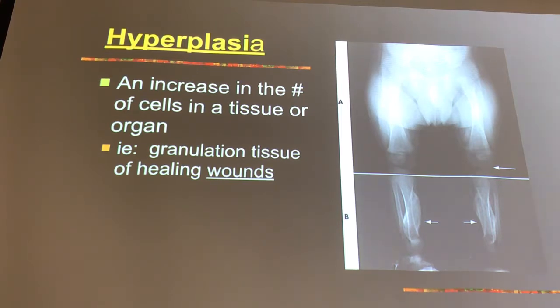Depending on the age of the patient. The tissue, depending on what kind of tissue it is. How much, right? So how much of what you're including in your image actually has it? So you're not going to just automatically change technical factors, except for the things that I start telling you you're going to automatically change them for. But for something like this, you may not. You're just going to go up there, you don't know what you're getting into, and you just take the picture, and then it's like, oh, you know, like this presenting.